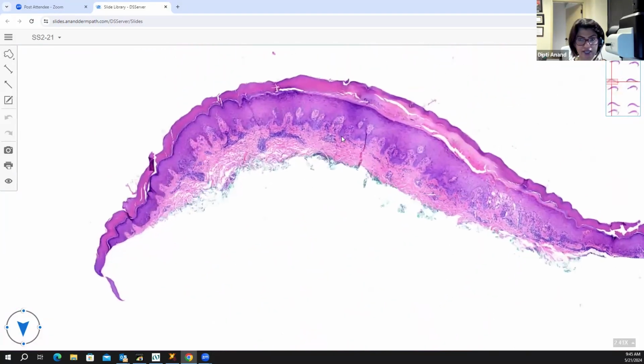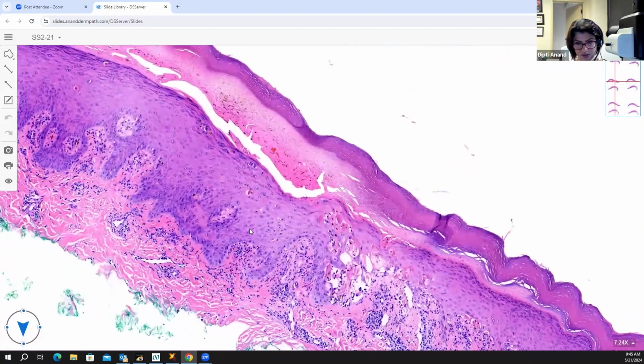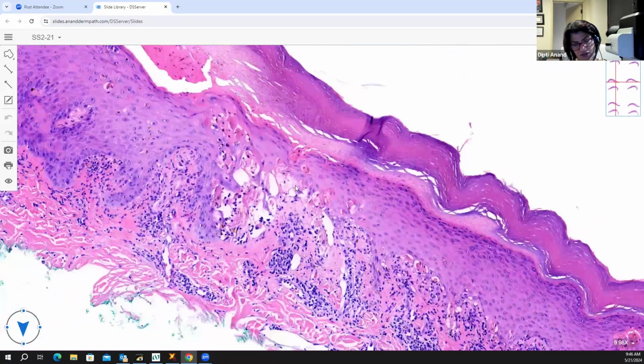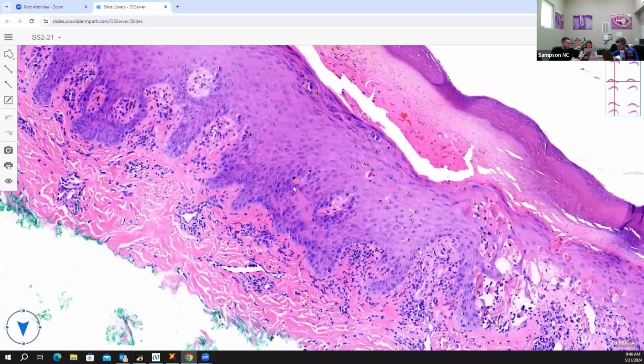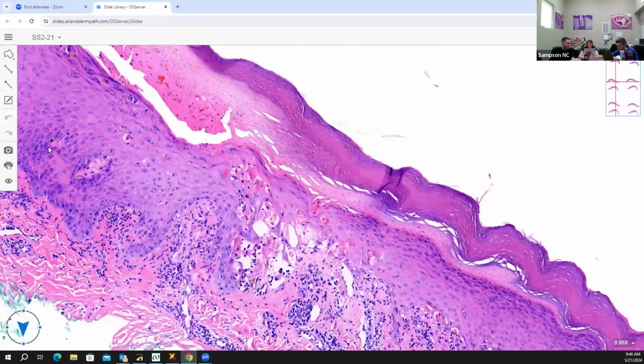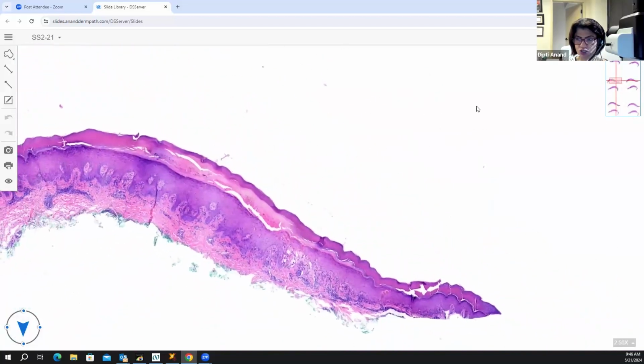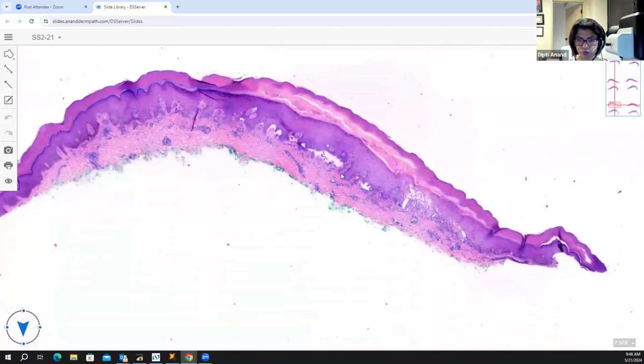It's not acantholysis, it's dyskeratosis. So what does it become when you see dyskeratosis? My differential at that point would be things like Darier, Hailey-Hailey, Grover's. No, I don't think those things. So it's not acantholysis. Dyskeratosis means dead cells. Perfect. Pink cells are dead cells. So when you see dead cells in the epidermis, under which category would you like to put it?